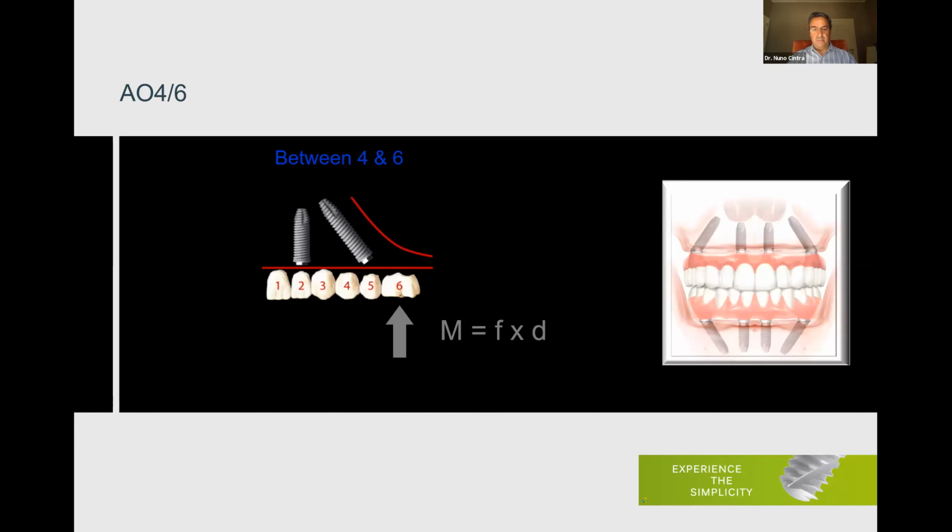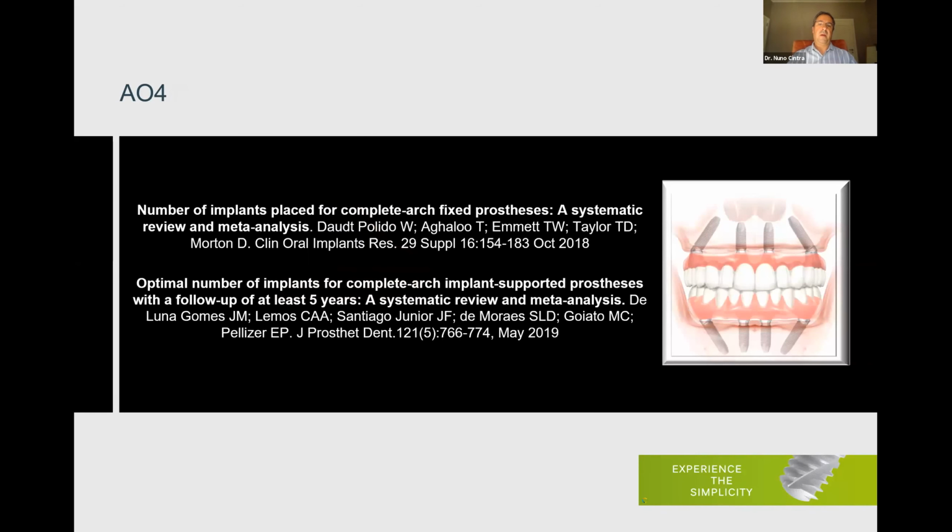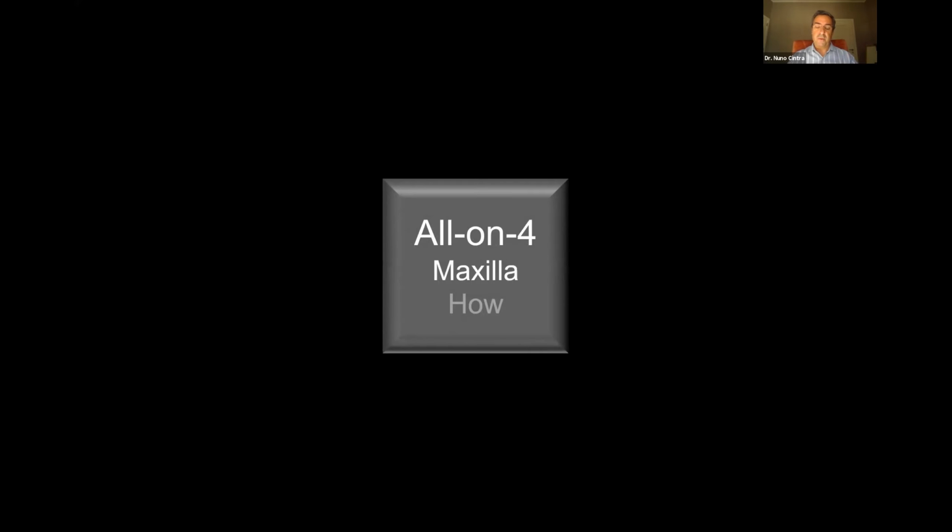Even today, you see these two articles are recent, 2018, 2019. What they suggest and conclude is that the optimal number of implants for a full mouth rehabilitation varies between 4 and 6. They don't need more than 6 implants for a full mouth rehabilitation.